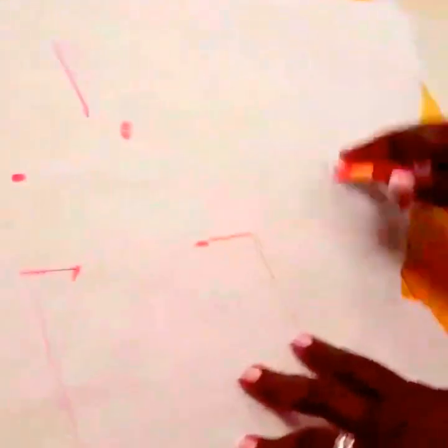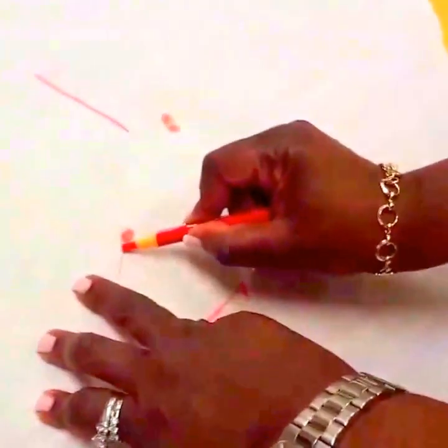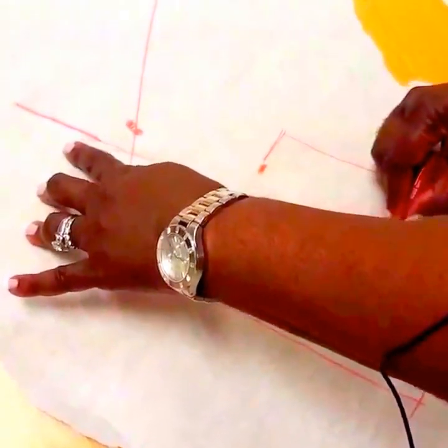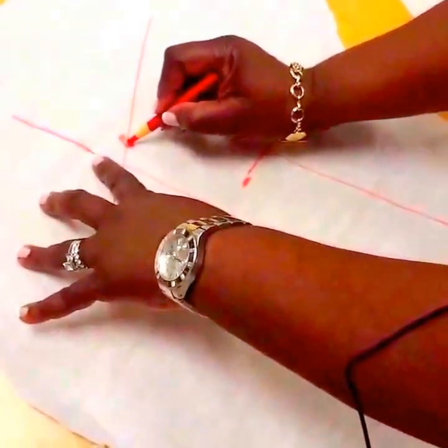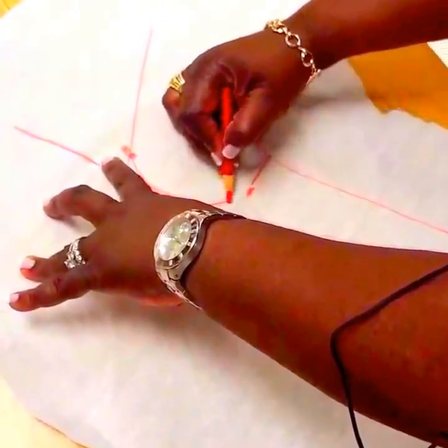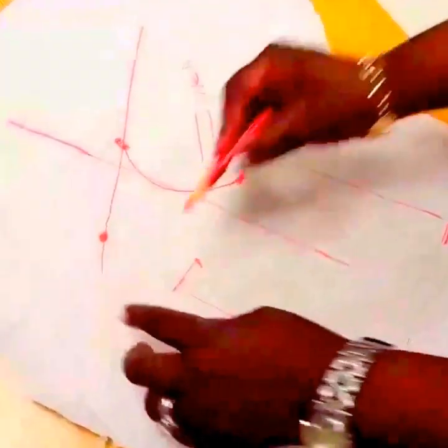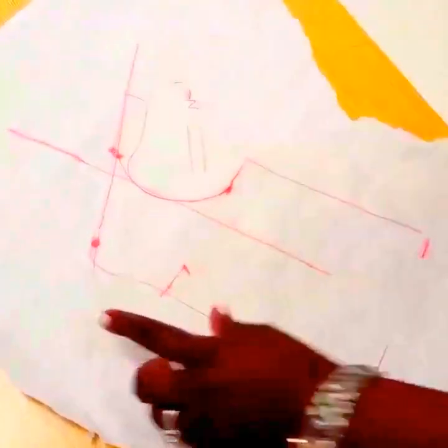The patient can remove the hand and now we're going to connect the dots. Connect the MC heads of the small and index fingers. Then extend the line from the second web space all the way down into the body of the pattern. Connect the marker from the index and curve around and connect it to the radial styloid to create that web space by the thenar clearance. Then complete the pattern and extend that portion to make the palmar bar.